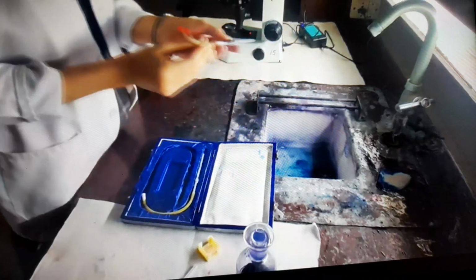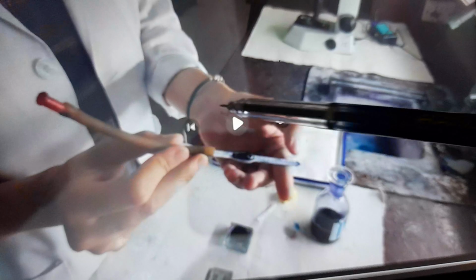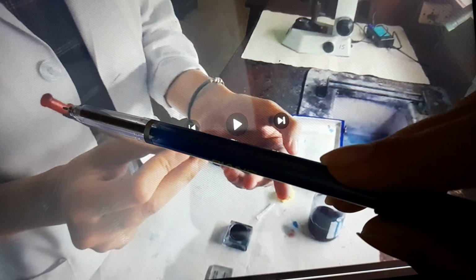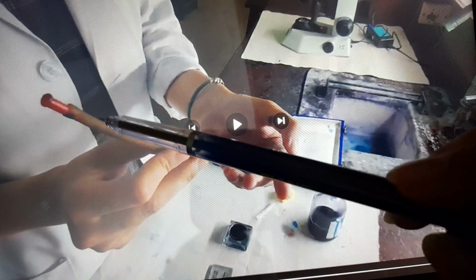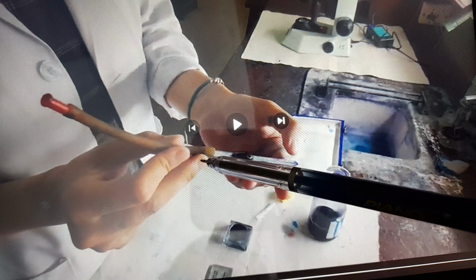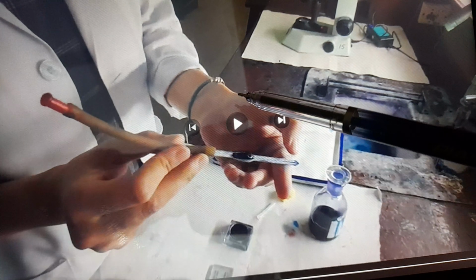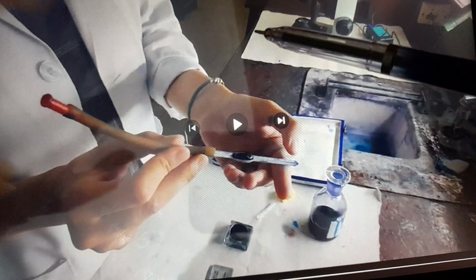Now we are going to watch how this girl will charge the Neubauer chamber. So actually we can see over here that the pipette being used is the red blood cell pipette. So she is going to determine the amount of red blood cells because it has a red bead, and also the red blood cell pipette had markings from 0 to 101, and the pipette bulb was larger but its lumen was smaller, as we studied in the difference.